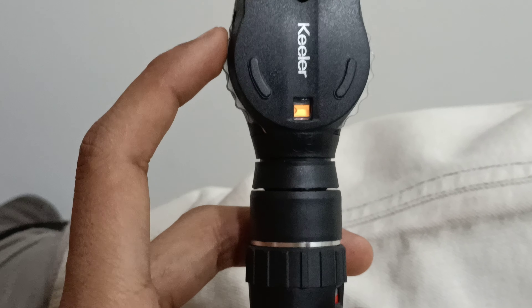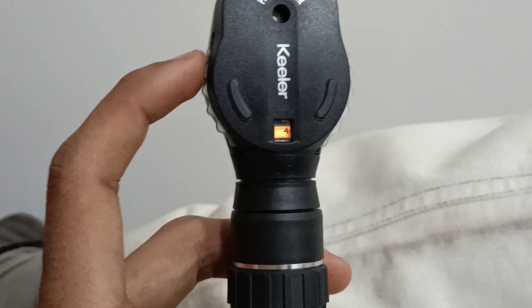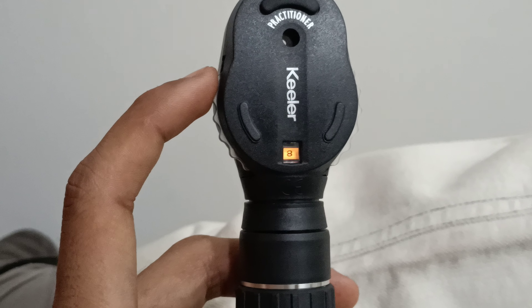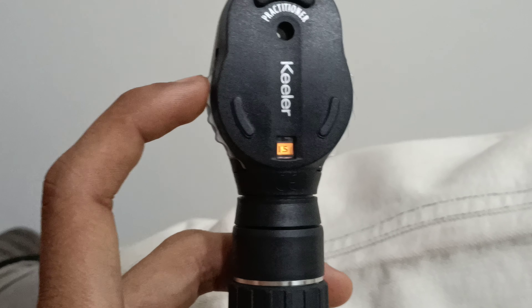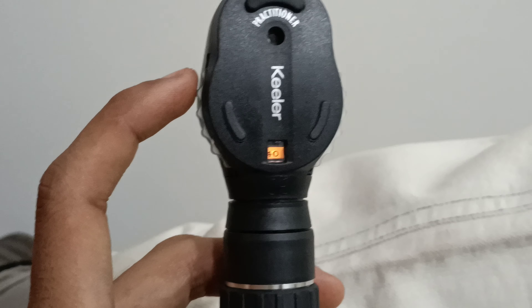Plus diopter values available are: 1, 2, 3, 4, 5, 6, 7, 8, 9, 10, 15, 20, 25, and 40.